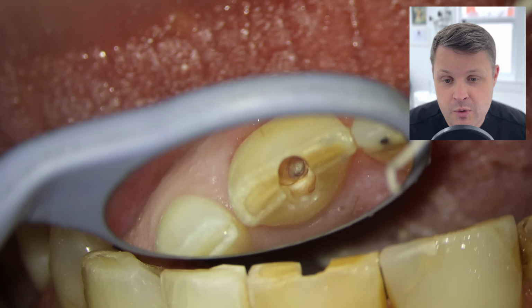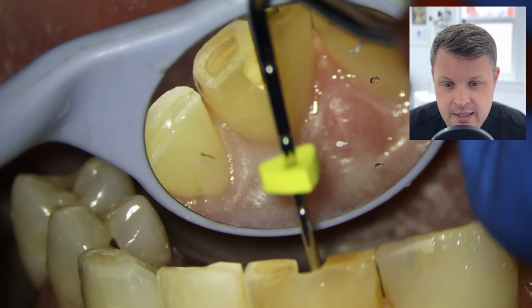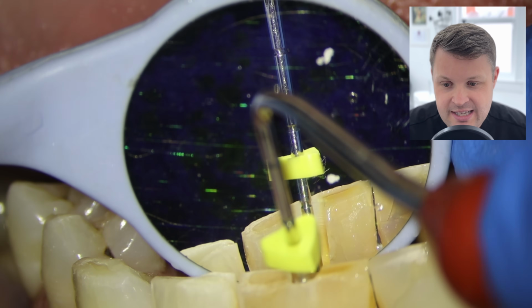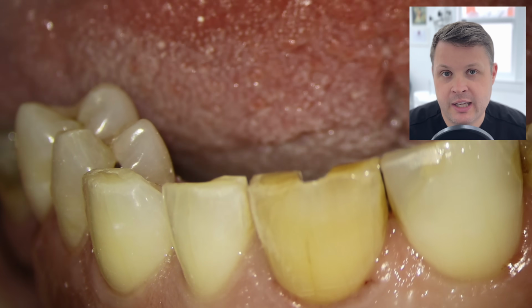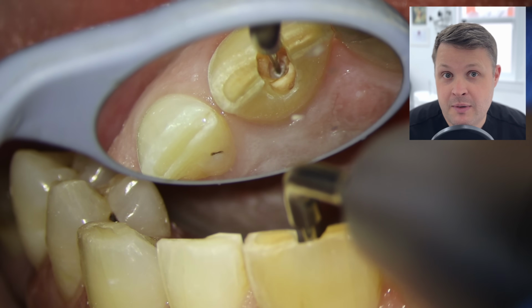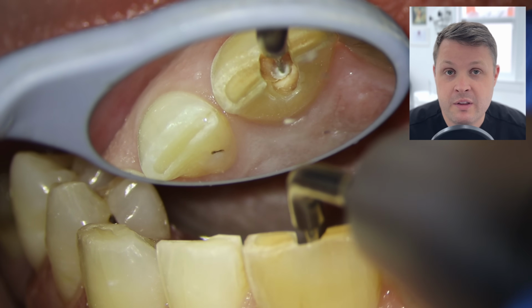But when we're using water here, the water can pool quite significantly deep down in the canal, so I'm just going to use a couple of paper points here. And when we look into the canal orifice, we can see that we have gone a little bit further. So we can see the Mach 2 plugger here with the depth gauge has gone a little bit further, but we're still too far away from the suggested point at which the orifice is with the cone beam CT scan.